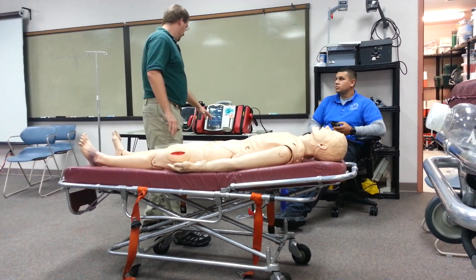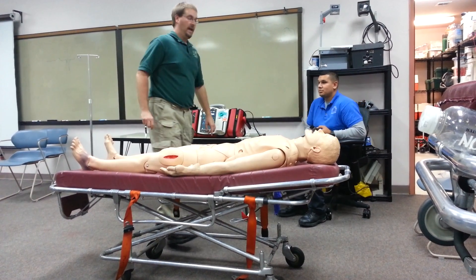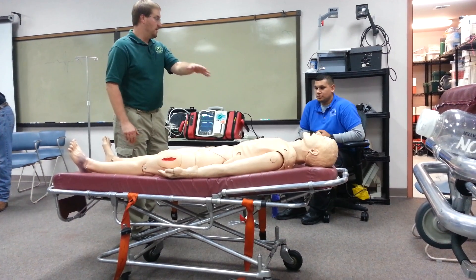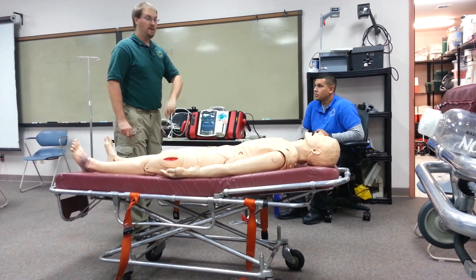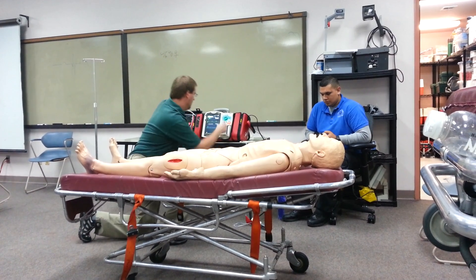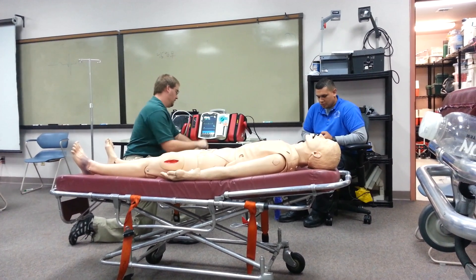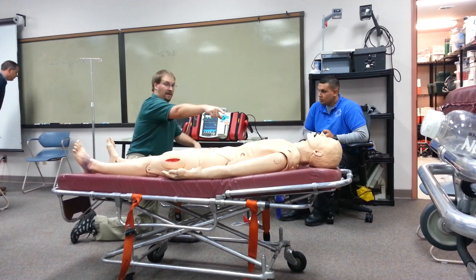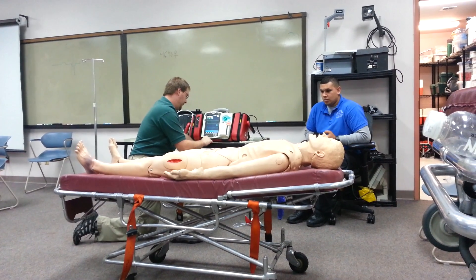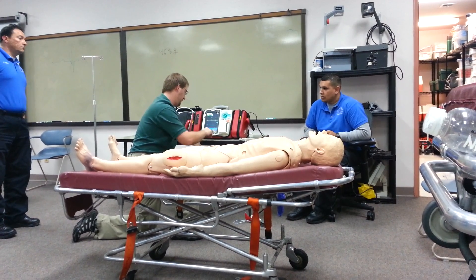I have a change on the monitor — it looks like sinus bradycardia. I want to verify there is or is not a pulse. There is a weak pulse. Can we get vital signs? No vital signs right now. I have sinus bradycardia with a very weak pulse. At this time, I want to consider transcutaneous pacing. I'm turning the monitor to PACER. Pads are already applied. I'll set my pacer rate at 70. Someone draw atropine 0.5 milligrams and administer it while I'm setting up the pacer.